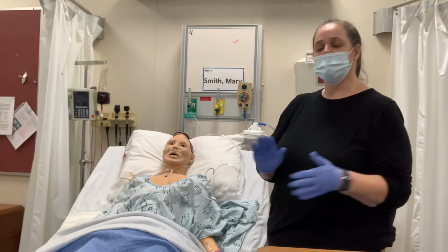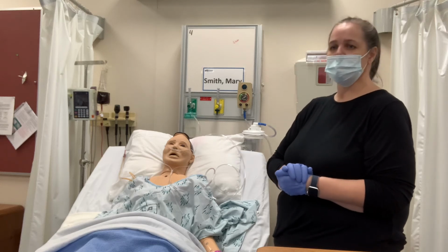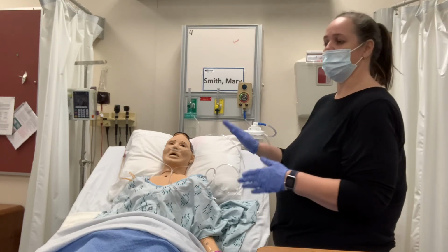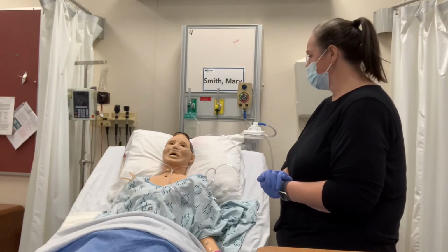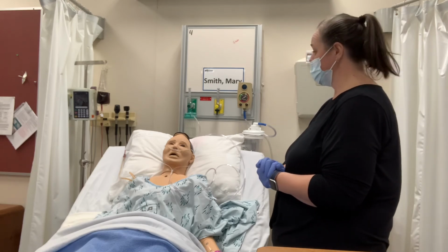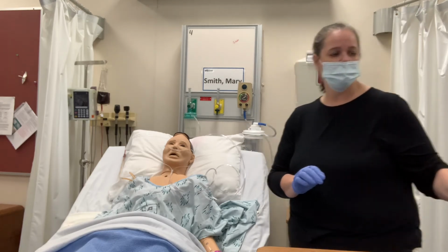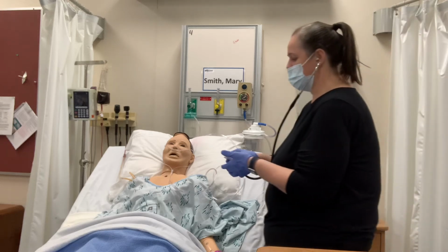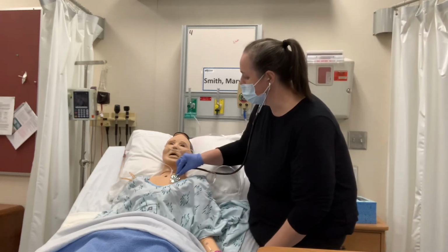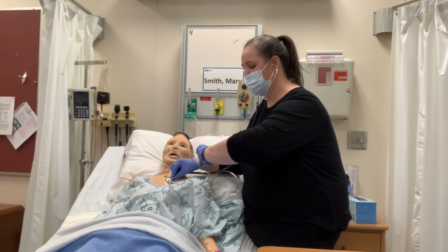So now I'm going to simulate a little bit of time has gone by, and then I want to reassess Mary using the same assessment criteria I used before to see if the intervention was effective. Mary, are you still feeling short of breath the way that you were before? You're feeling a little bit better. That's good to hear. Is it okay if I listen to you breathing and listen to your heart rate again? Okay, so I'm going to put this stethoscope on your chest again here and listen. You just breathe like normal.